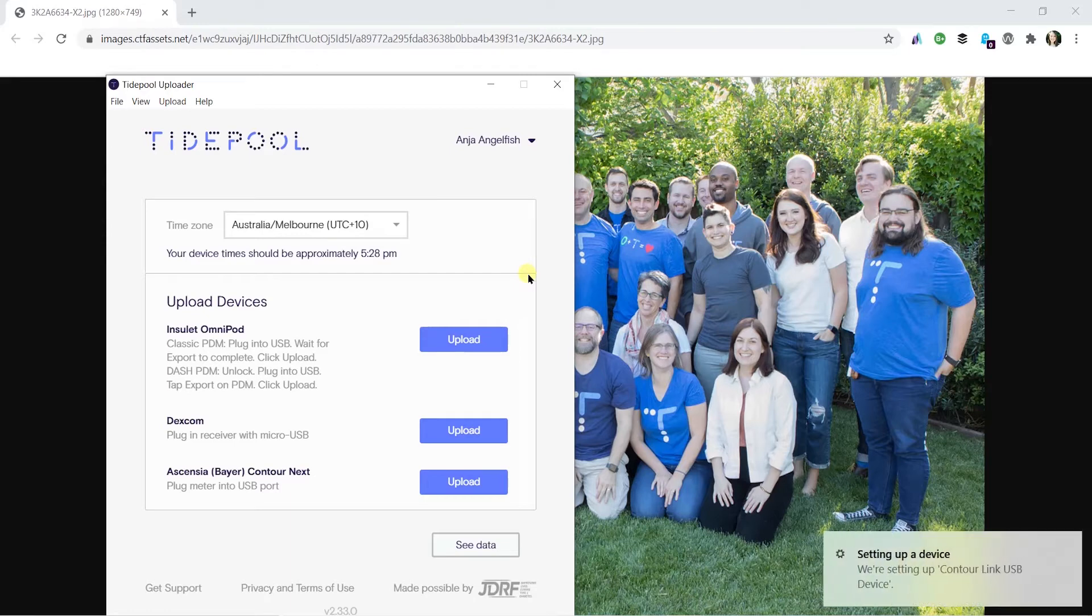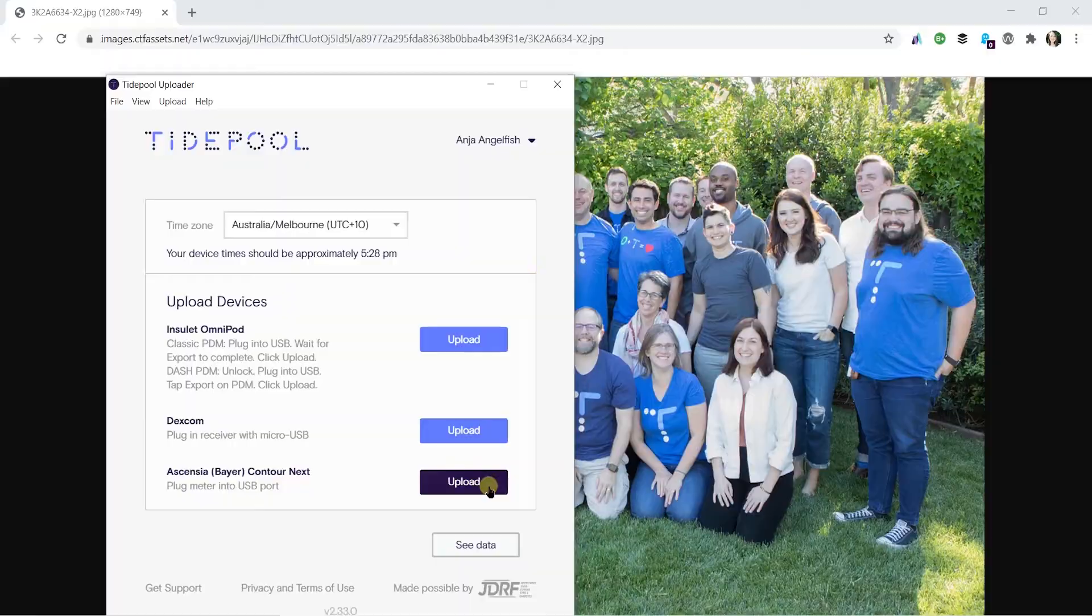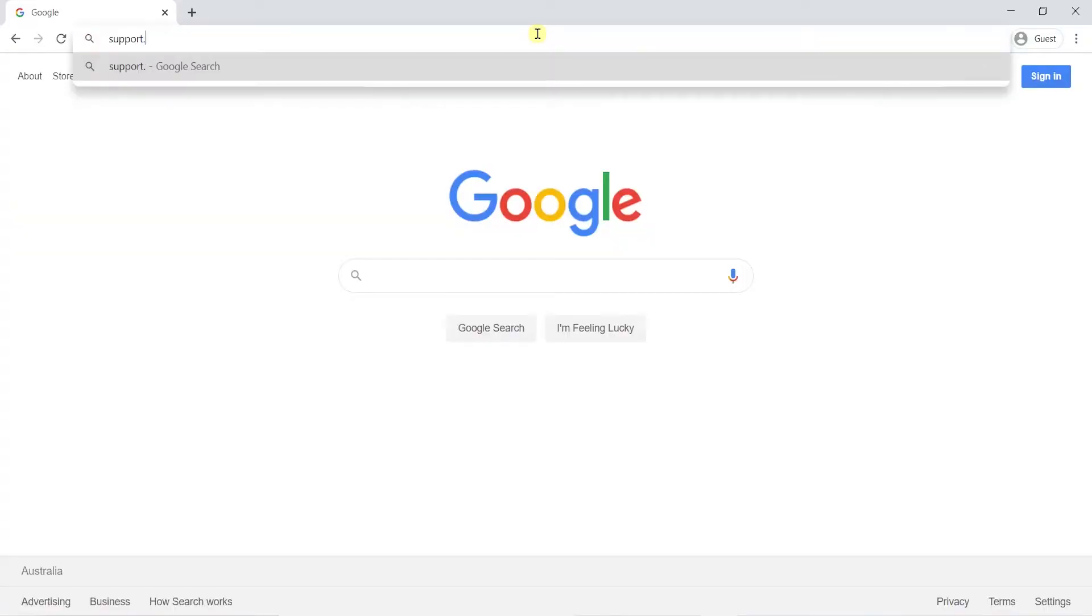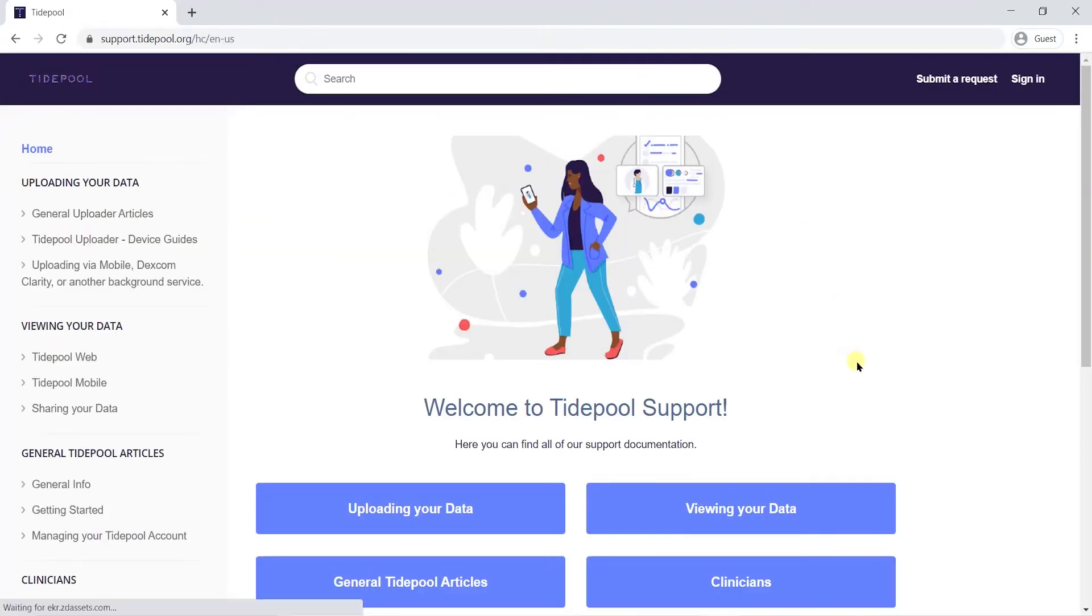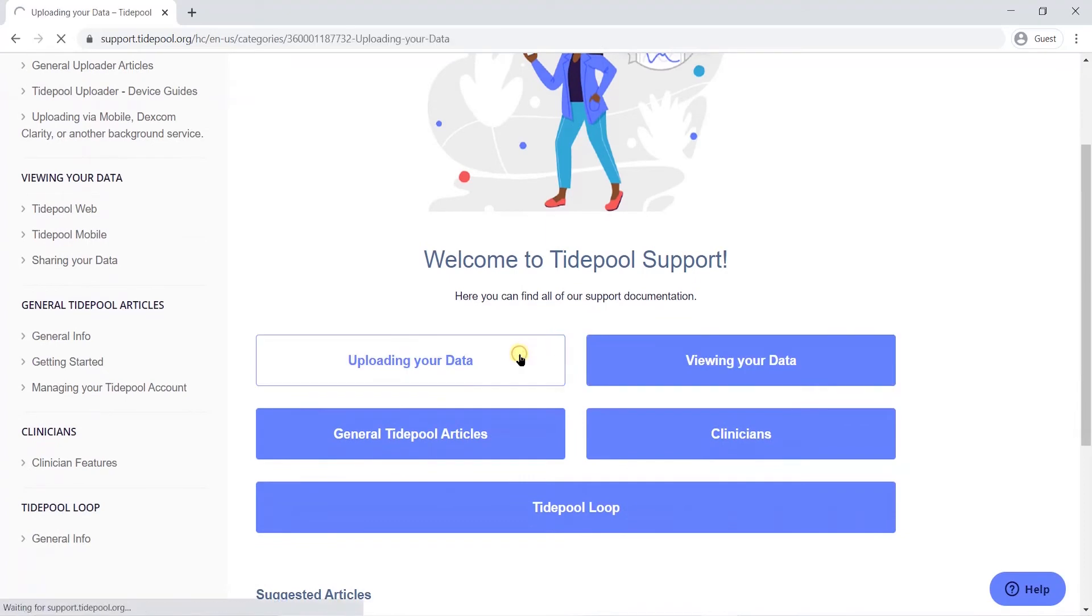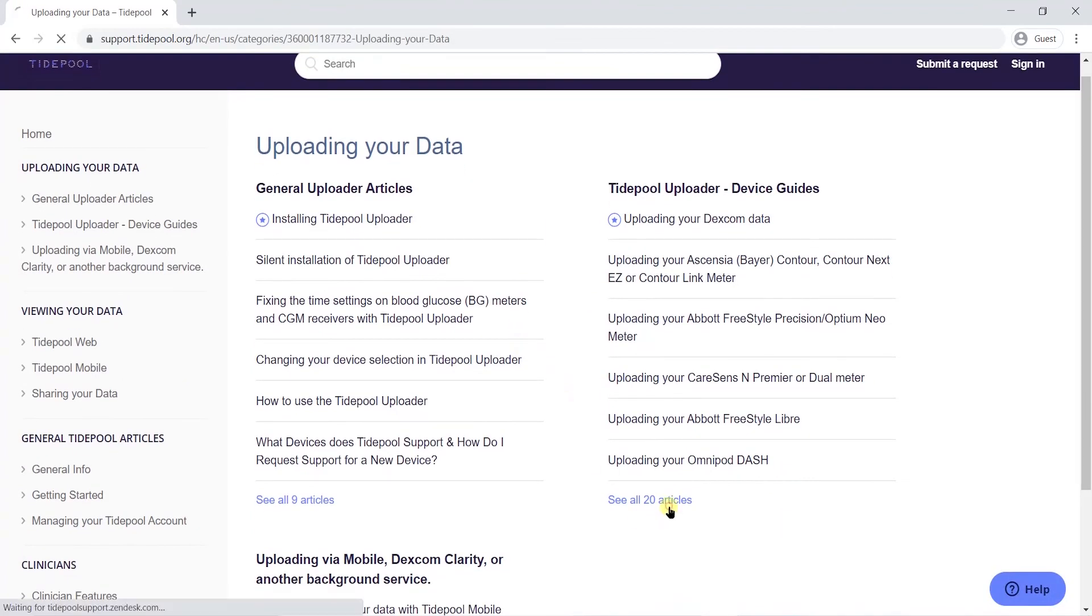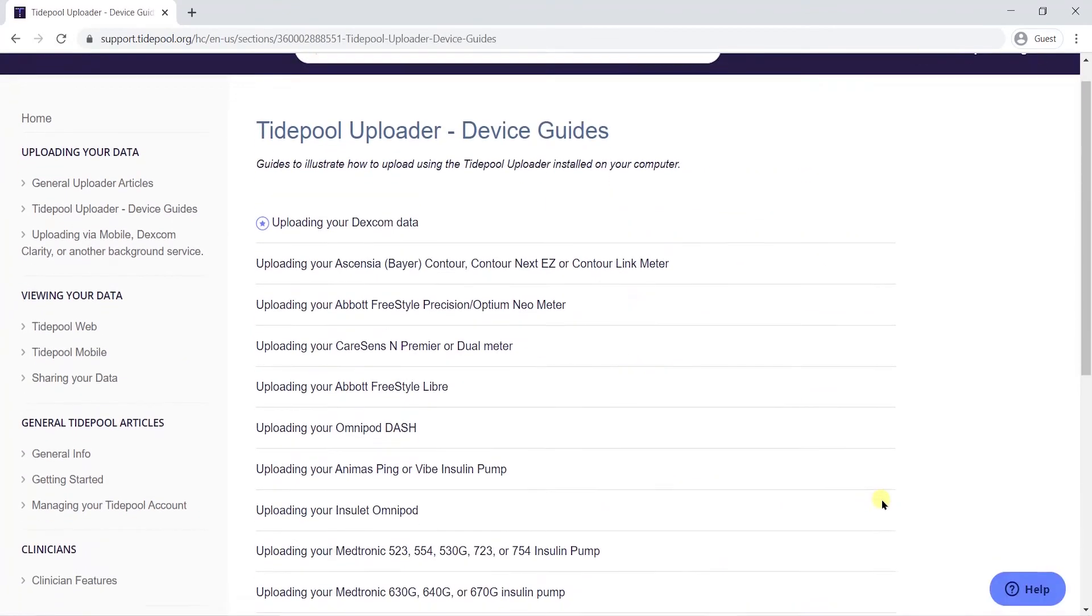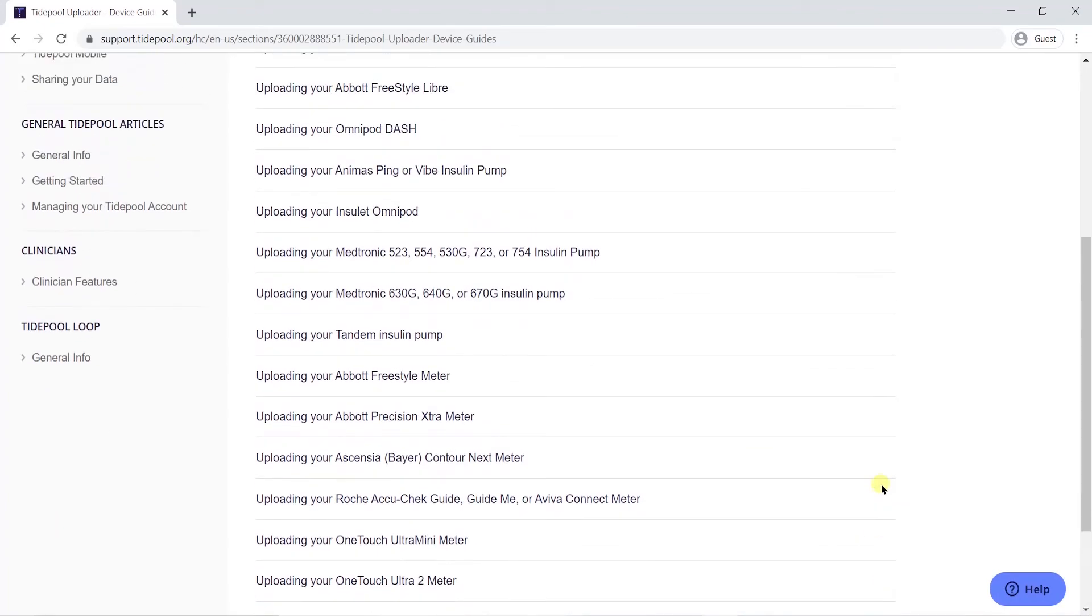Now that the setup is out of the way, let's get to the data uploading. Simply connect your diabetes device to your computer with a compatible USB cable and click Upload. You can find full instructions for uploading data from each of our supported devices, including which USB cable or connection is required to connect to your device, at support.tidepool.org.